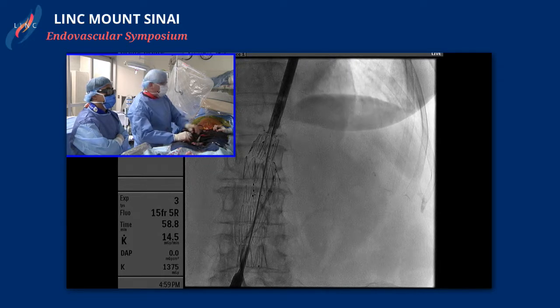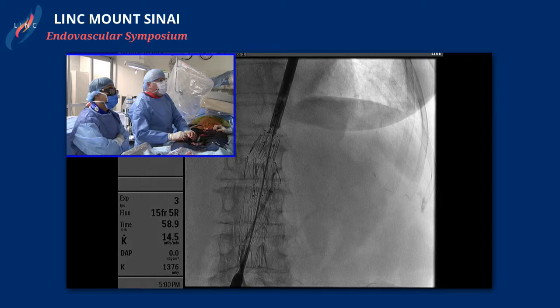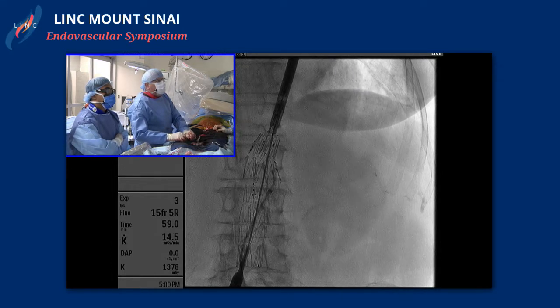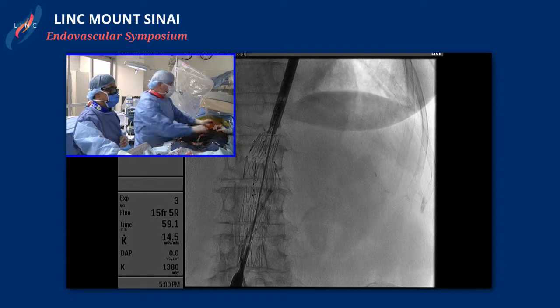It keeps teasing us, but we are just working away here, trying to get close. You can see we've got the seven French sheath going into the graft. We're working right at the area of the fenestration. It's right up against the wall, but we have shown that we do have good flow into the renal once we get into that area. We just have to get through that calcific plaque.